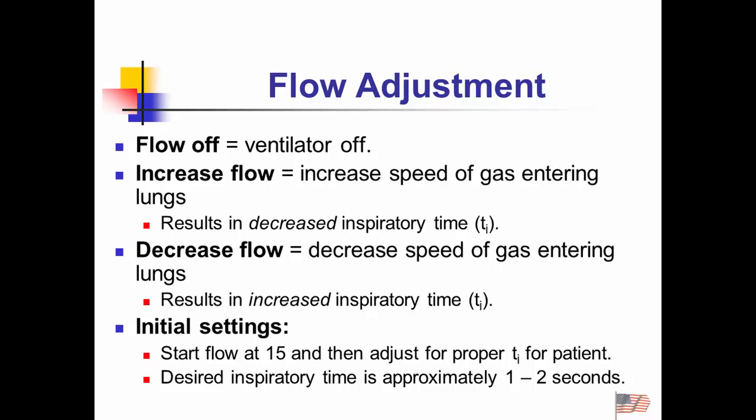So what's turning it off? I'm reaching a certain pressure. If I have the flow faster, it's going to get there quicker, shorter inspiratory time. Make the flow slower, it takes longer. I have an increased inspiratory time.